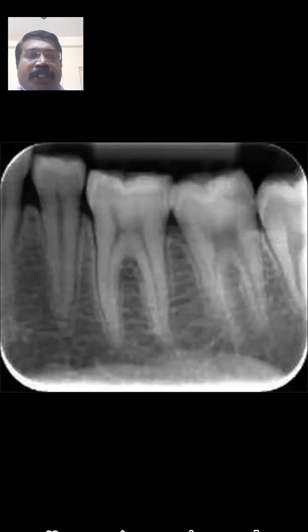When plane or projection images are used, multiple images at slightly different projection angles, as well as images made at right angles to one another, can provide additional information to the normal radiograph that we take. So when we take a radiograph, we can take some additional radiographs at right angles to each other so that it can give a three-dimensional representation of that area of interest.